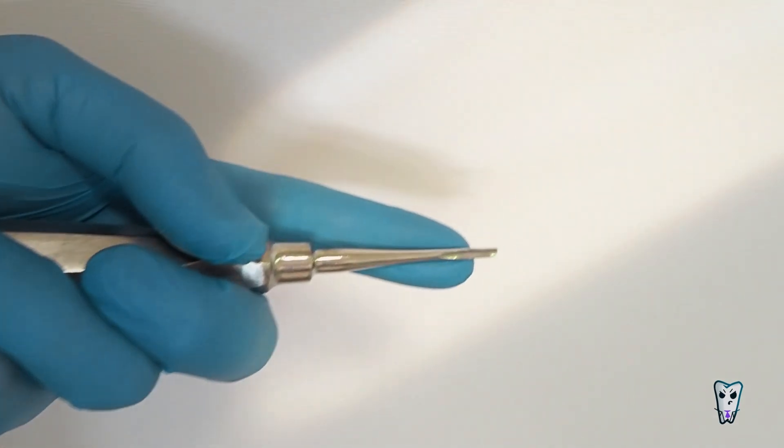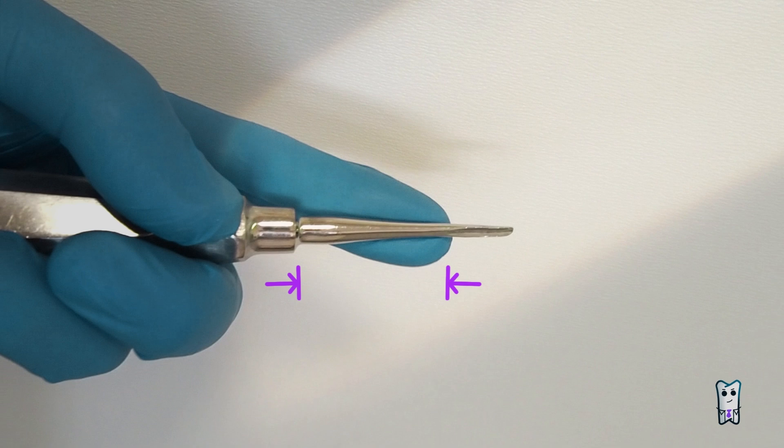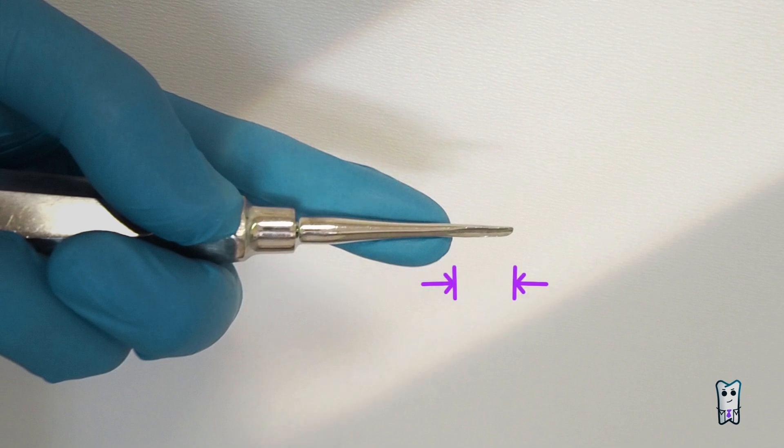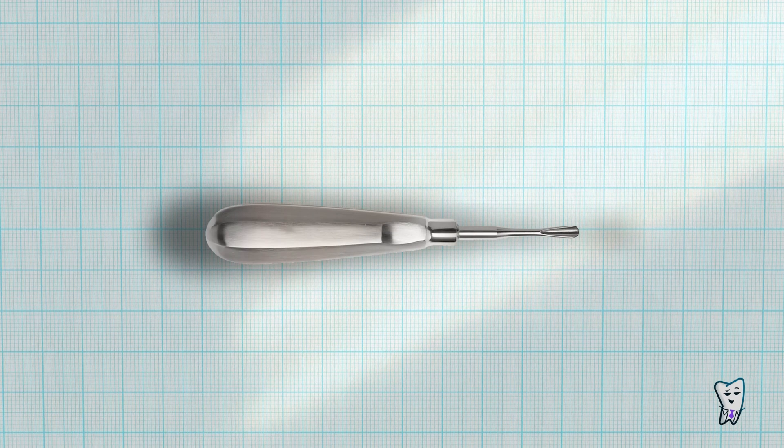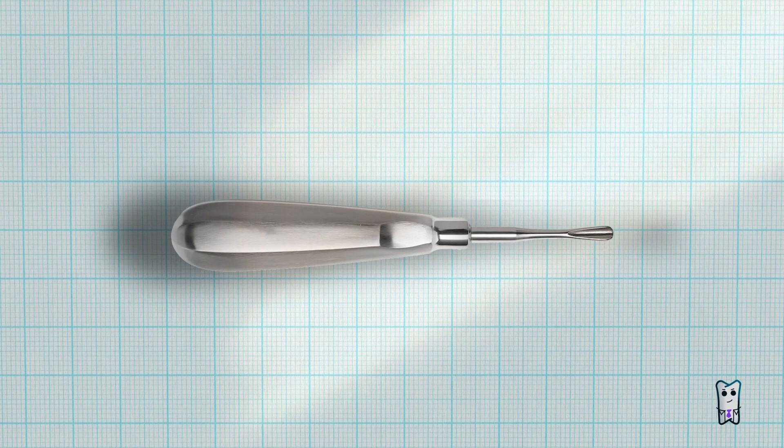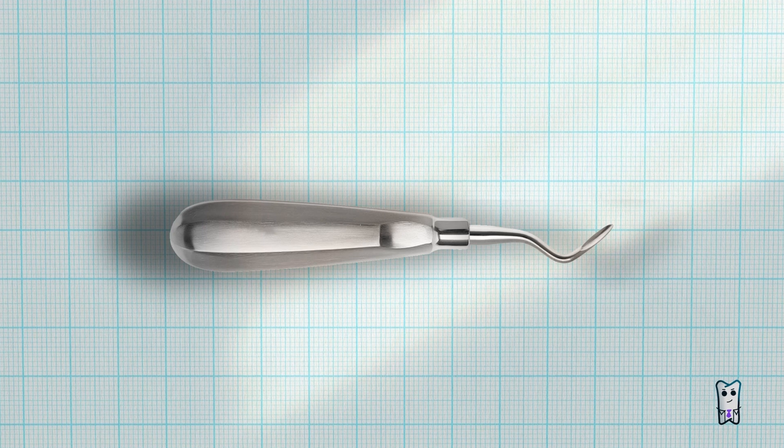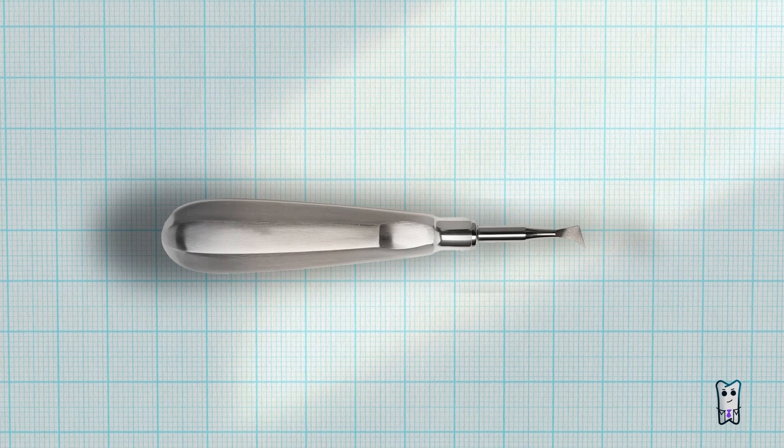The shank connects the handle to the blade. It should be strong enough not to bend upon the force you apply. The blade is the working end of the elevator. We have a lot to talk about the blade. When we are talking about different types of elevators most of the time the blade is the part that differs.